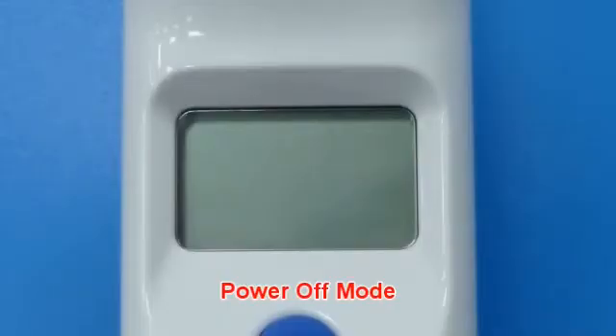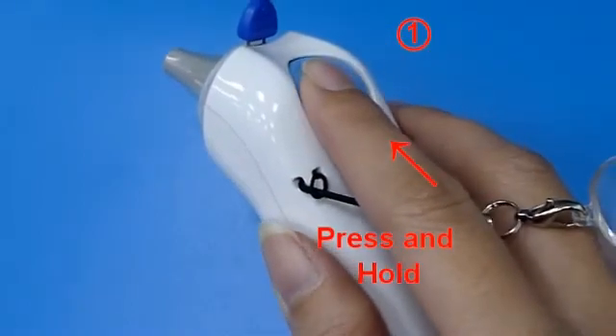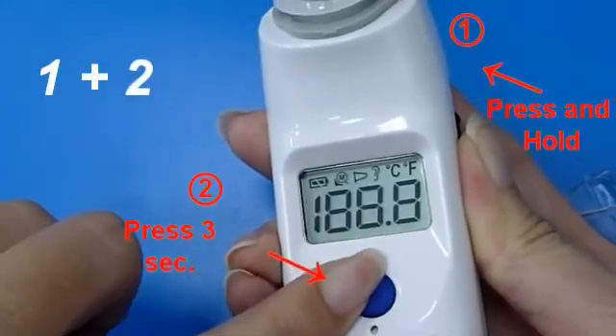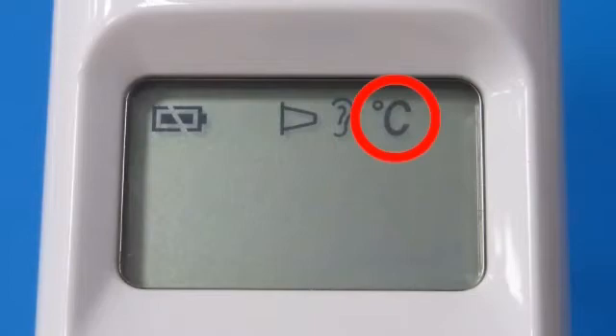In power off mode, press and hold the scan button, then press the memory button for 3 seconds. The icon Celsius will be switched to the Fahrenheit icon. You can also use the same process to change the LCD display from Fahrenheit back to Celsius.